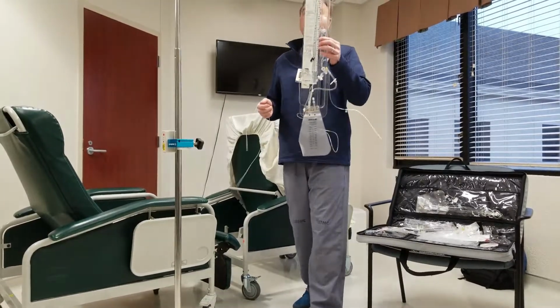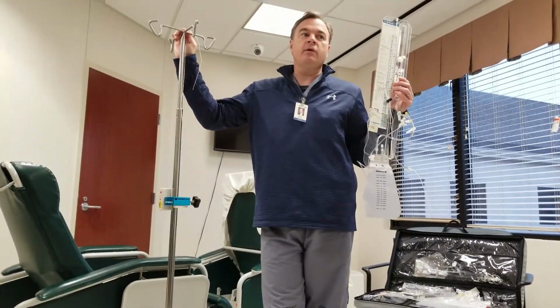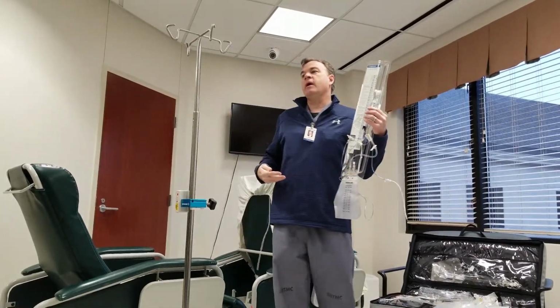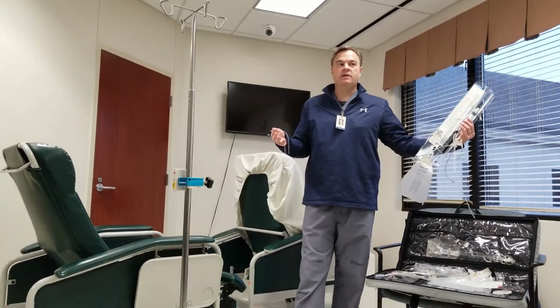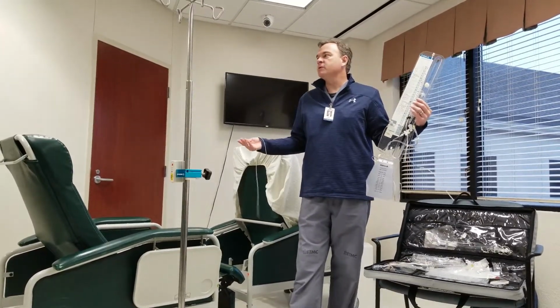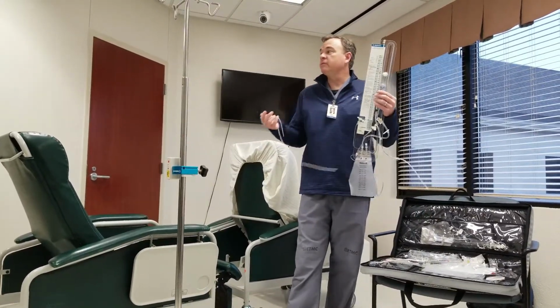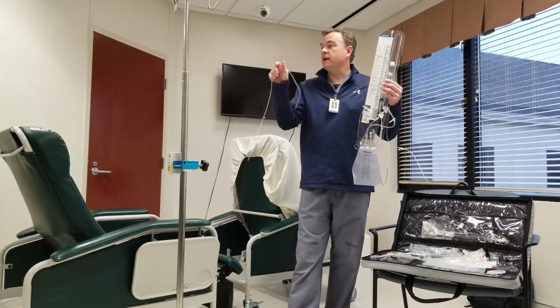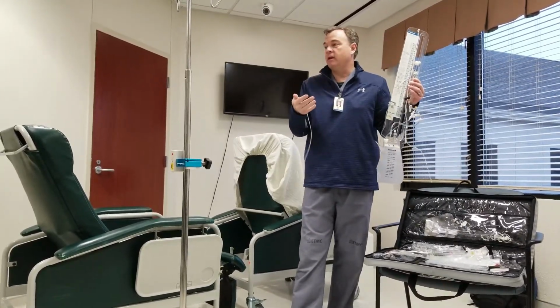The pressure setting is something you see particularly if you have a dural leak. In most instances, something is going on with the patient where they either have increased ICP, which is the pressure of your cerebral spinal fluid, or there's a leak. Most of the time when you see this, something has happened in surgery, there was a revision, there's a small tear. Now they want to relieve some pressure on that little seal. They put a patch, they put some sealant down, and they don't want a whole bunch of CSF pressure pushing against that patch as the body's trying to heal. And that's all they're trying to do.